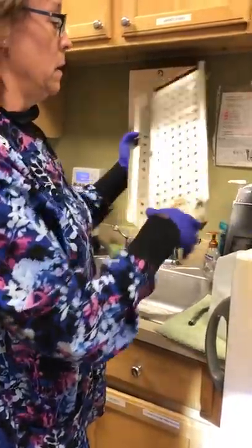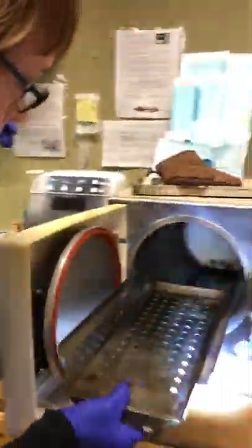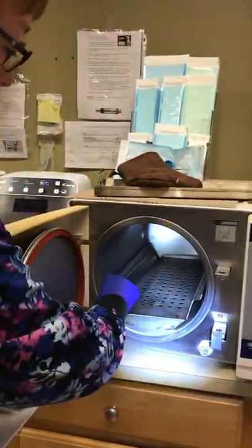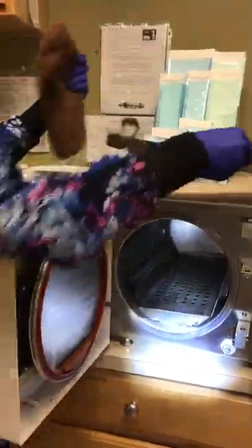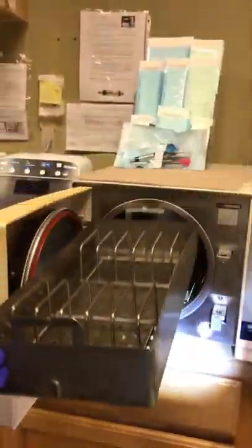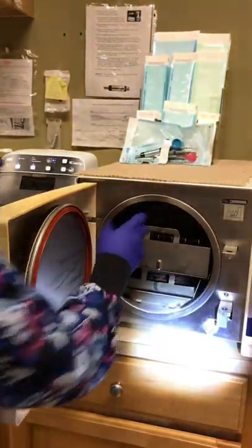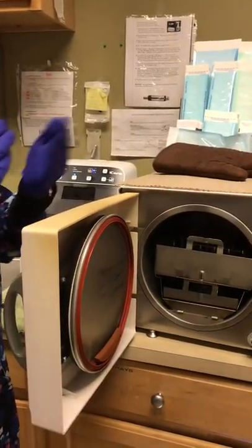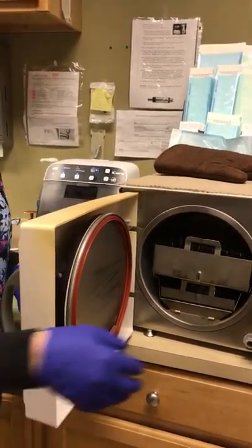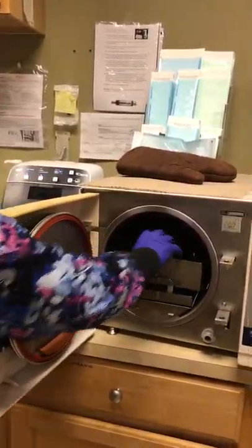Everything that's in there, scrub it down, and that's ready for operation. This is done once a month. I usually go on Thursdays or Mondays because there's not as much shift-switching — it's usually calmer days.